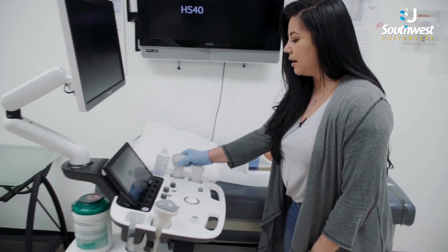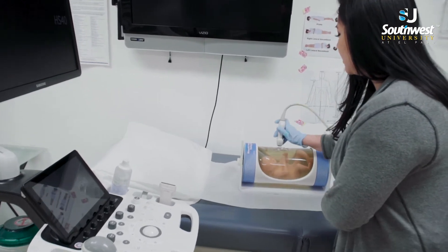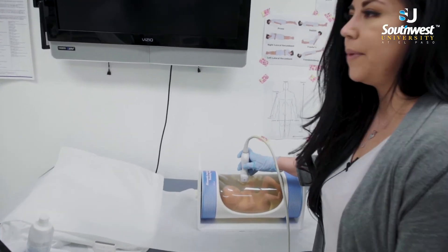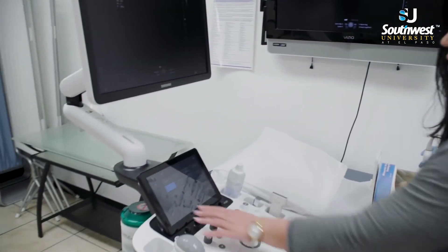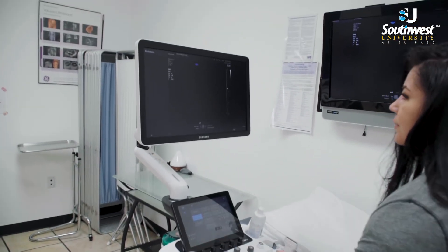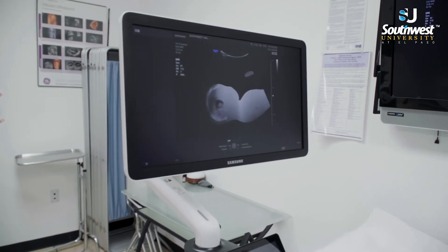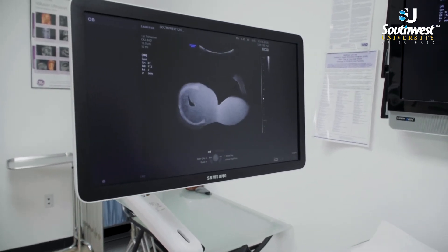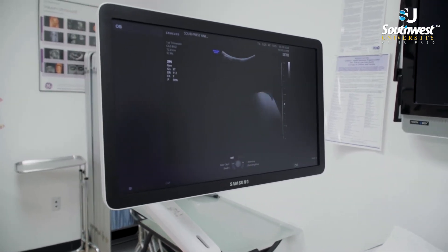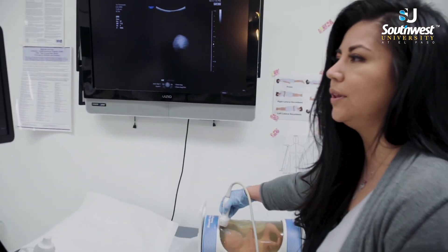For example, if we put the camera on the baby, we'd be able to see the baby on the screen. Without the gel — if I were to remove the gel — we really can't see anything.